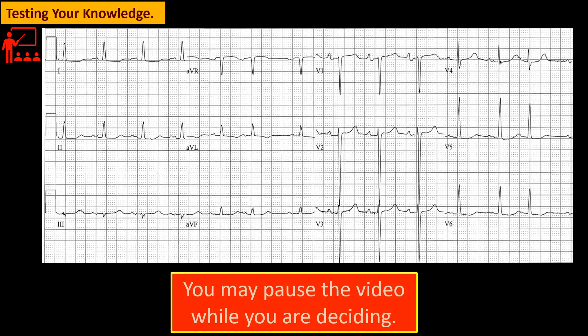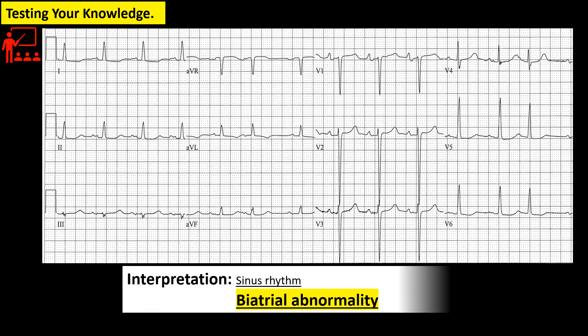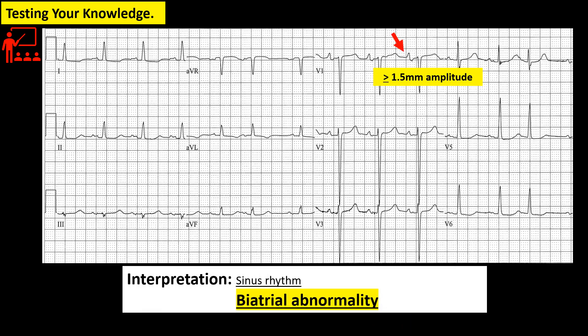How about this tracing? This is biatrial enlargement because it fulfills both the criteria for right atrial enlargement and left atrial enlargement.